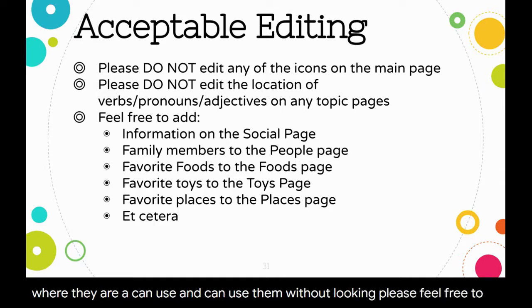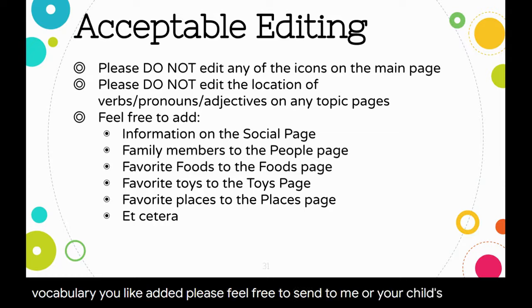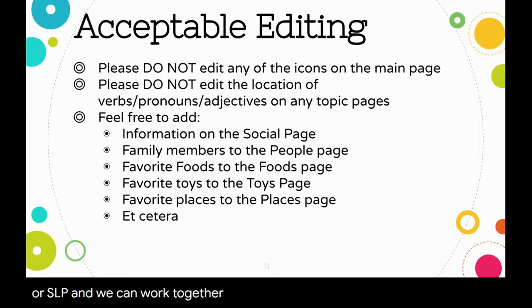Please feel free to edit and add information on the social pages, people pages, foods, toys, or places page. If you don't feel comfortable editing within the device, but you have vocabulary you'd like added, please feel free to send it to me or your child's teacher or SLP, and we can work together to get it added.